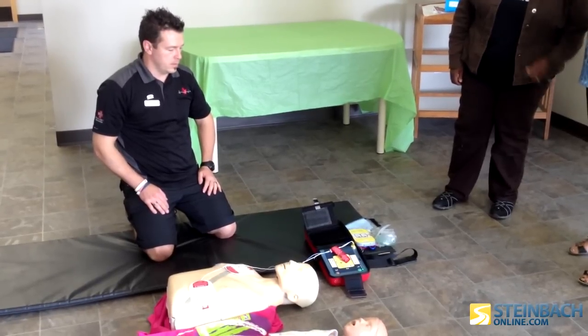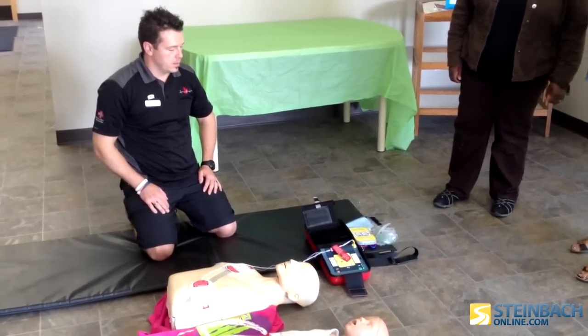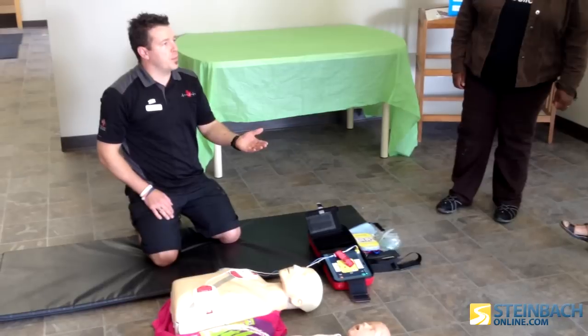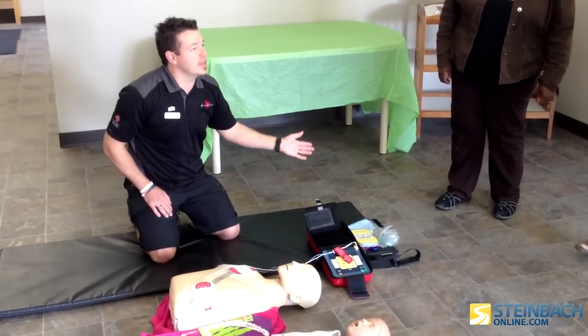It is safe to touch the patient. Begin CPR. For help with CPR, press the flashing blue button. The question is: is it possible you won't remember how to do CPR?